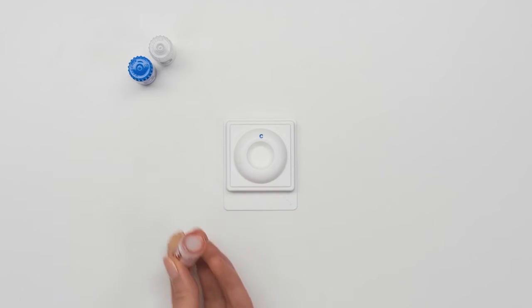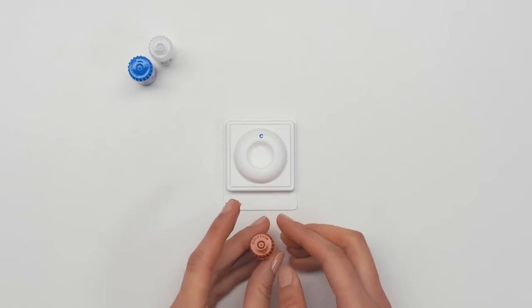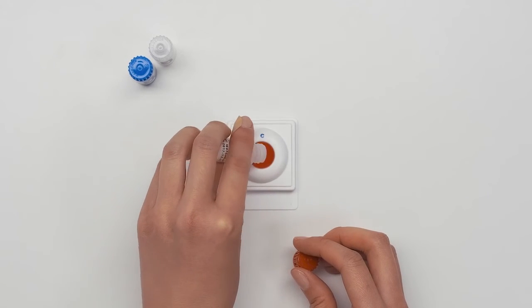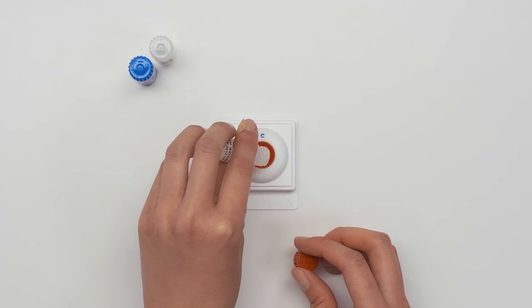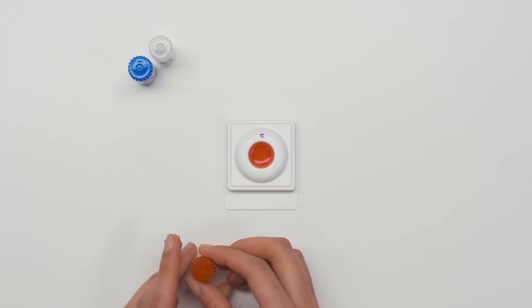Shake bottle 1 four times and pour all of the liquid into the test device. Wait until the liquid disappears.